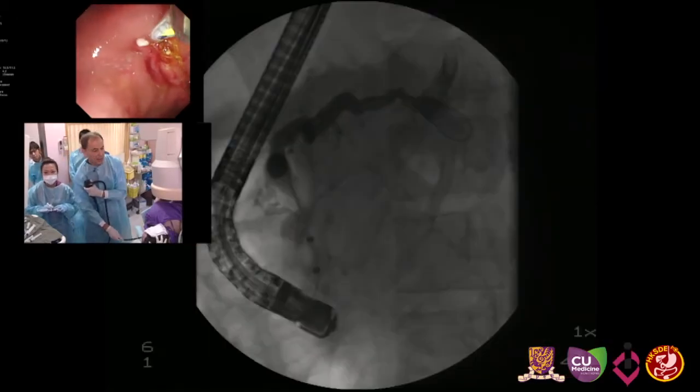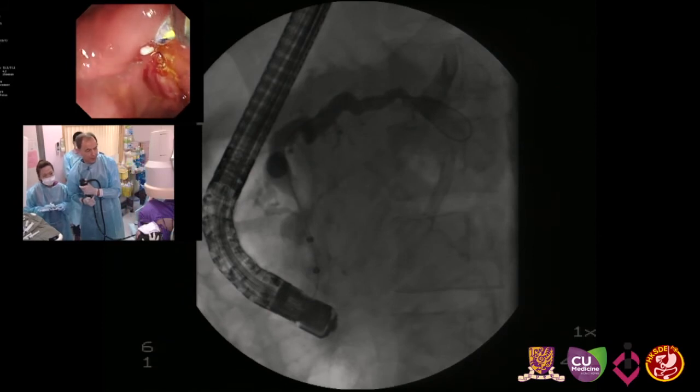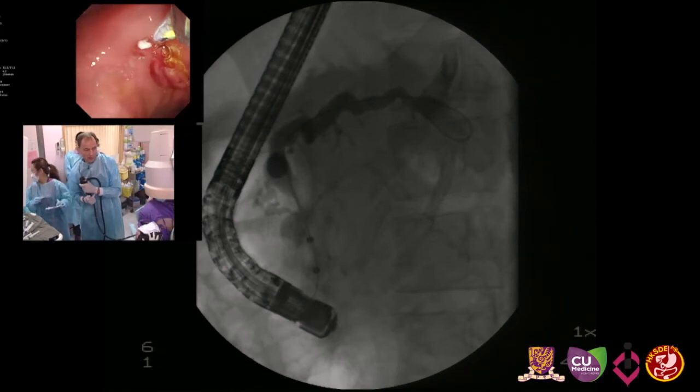Yes. And as you can see, now there is a stricture still quite close to the papilla, but we removed all stones. The balloon is just at the level of the papilla, but there are no more stones inside the duct. Therefore, we will dilate the stricture now to 6 millimeter with a Hurricane balloon, followed by stent implantation, probably an 8 to 10 French, 6 centimeter stent to keep the stricture open, but at least the patient is free of stones.